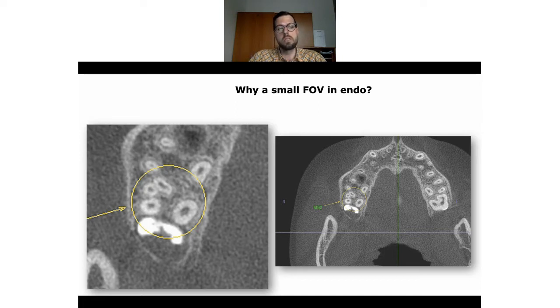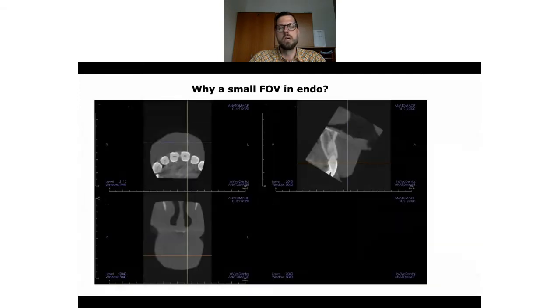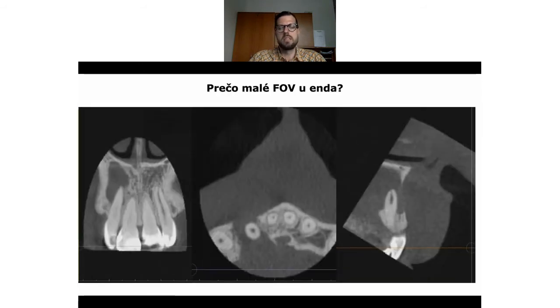It's bigger, yes, but the resolution has gone. Here a better way to go is to choose a smaller field of view, for example 5 by 5, and you see that now I can make it bigger, not outside the program, but in the program. And I see that the images are bigger, but we are not losing the resolution.